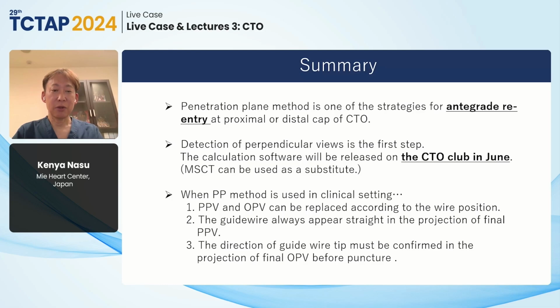And the direction of the guide wire tip must be confirmed in the projection of the final OPV before puncture.